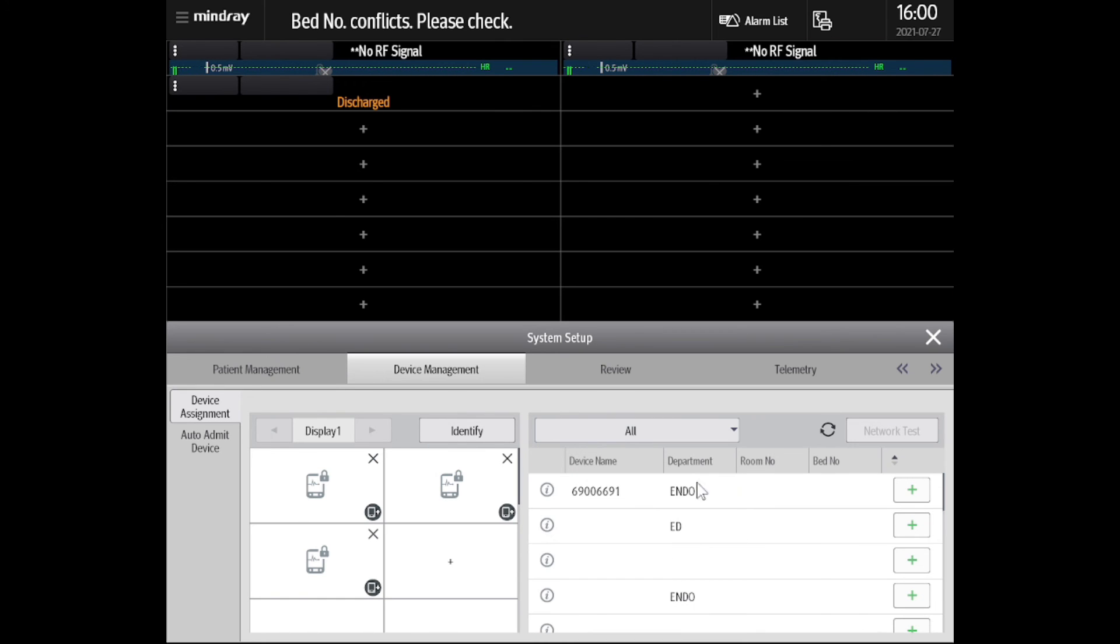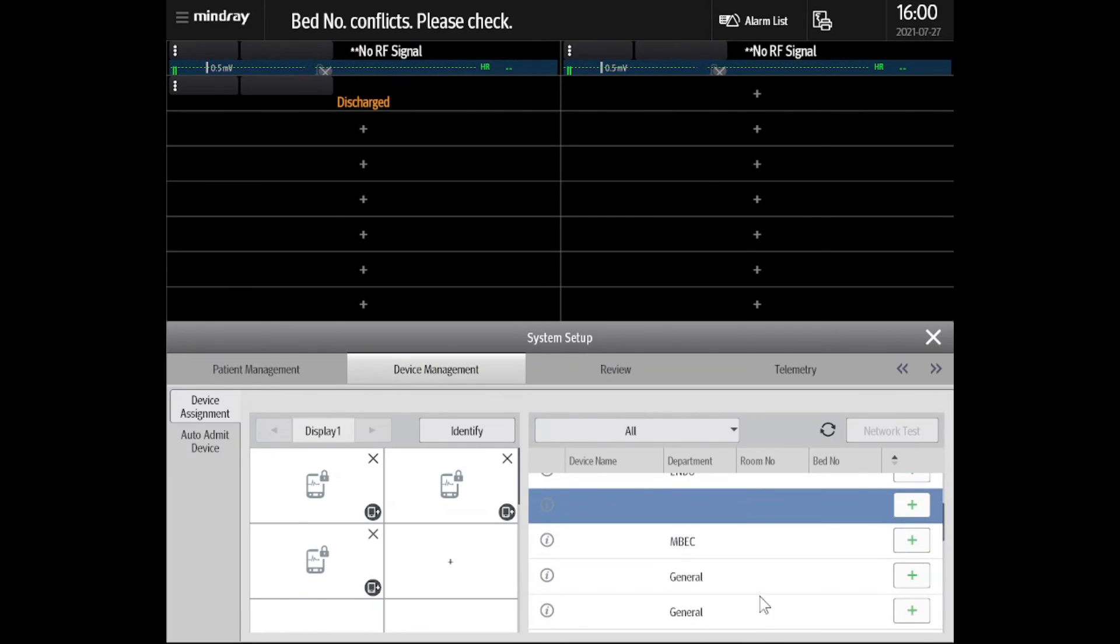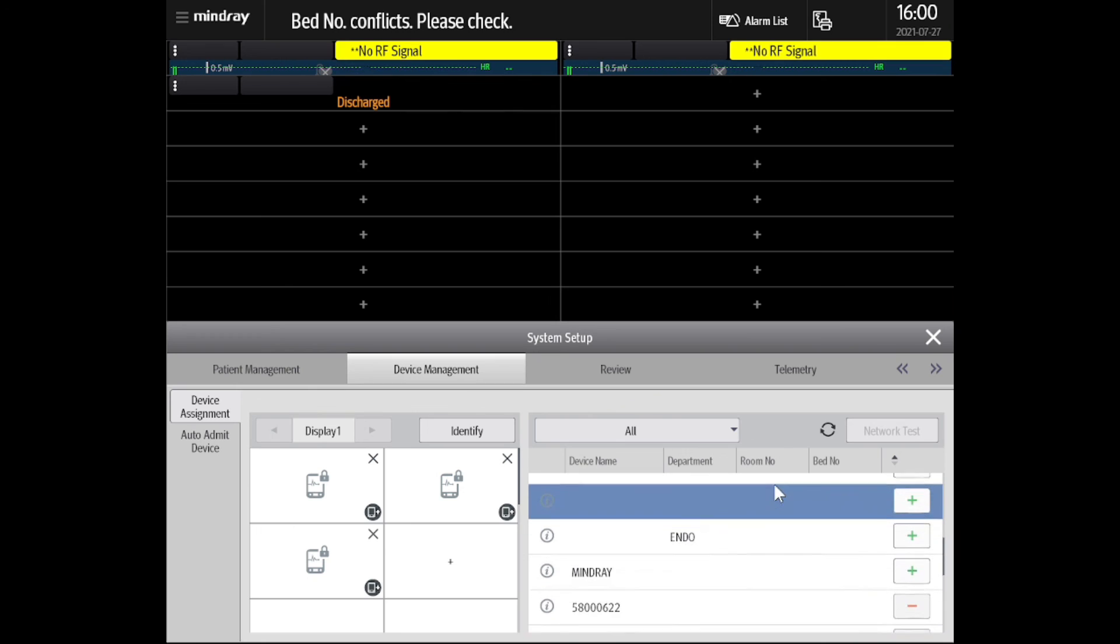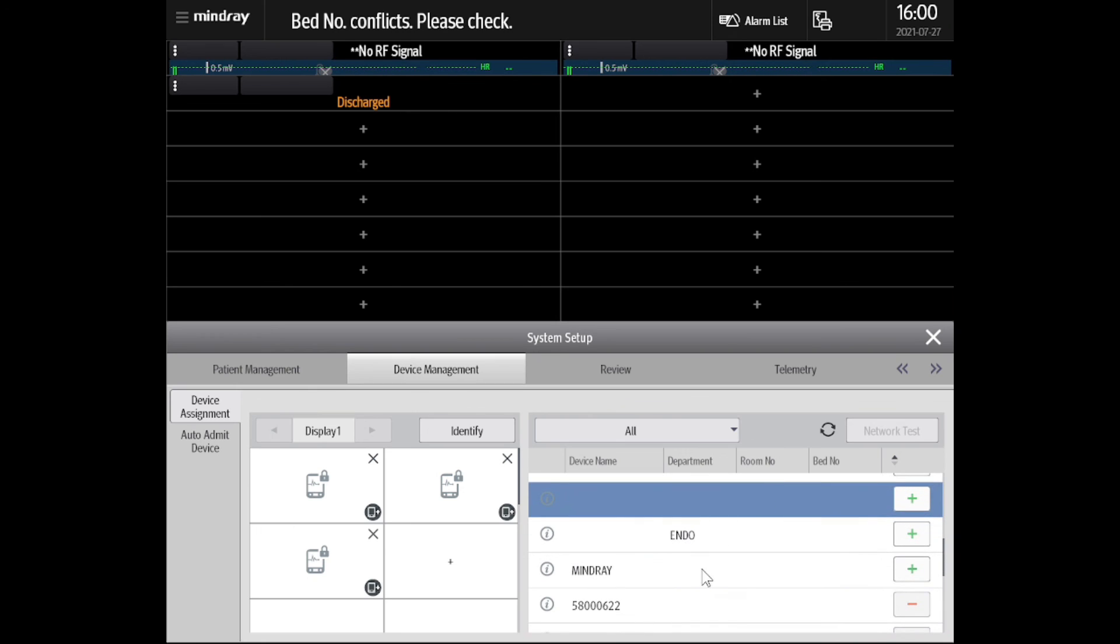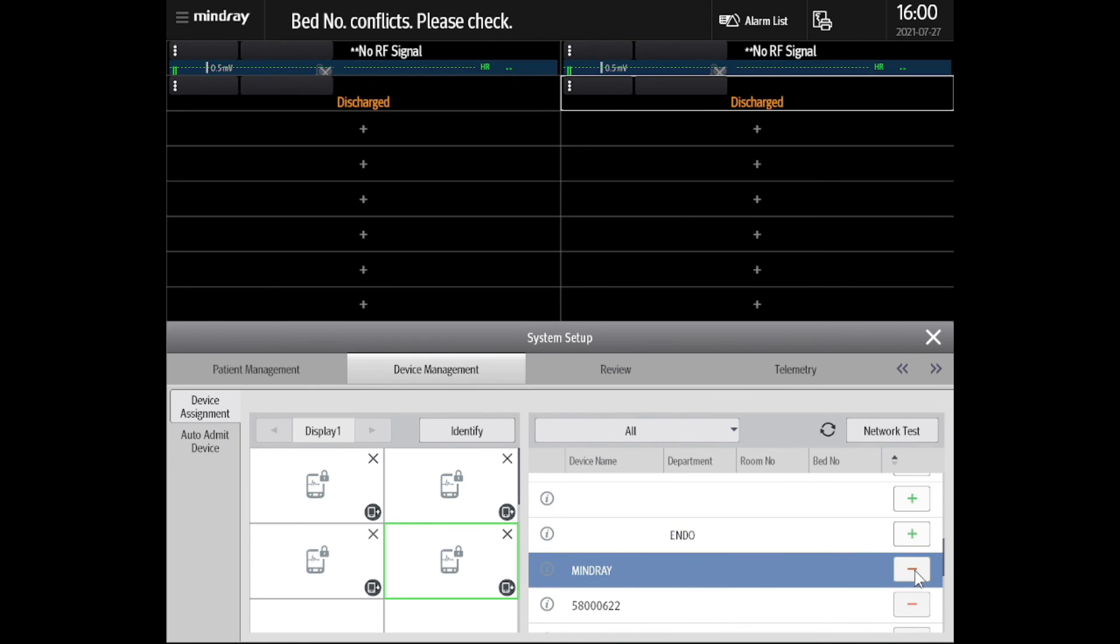From the list, locate your new device by the device name, which in this case is Mindray. Then select the green plus icon to add the device.